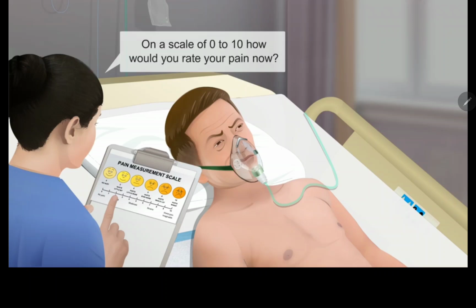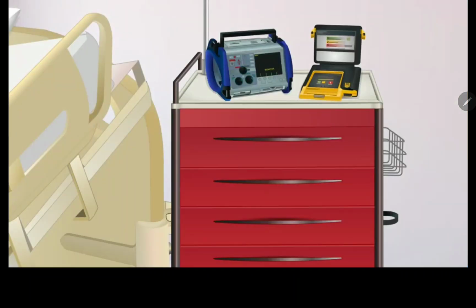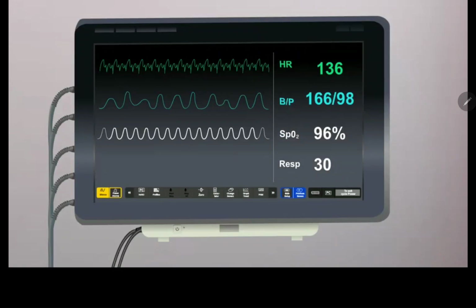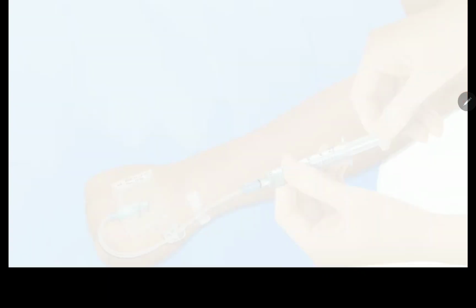Administer prescribed medications. If sedation is needed for the procedure, perform moderate sedation monitoring per the organization's practice, and ensure that emergency response equipment is available. If a sedative or an analgesic is administered, reassess the patient's pain or sedation status, allowing for sufficient onset of action per the medication, route, and patient's condition.